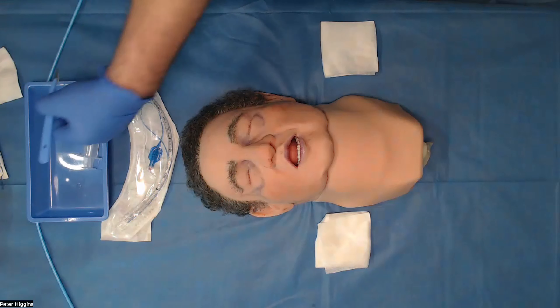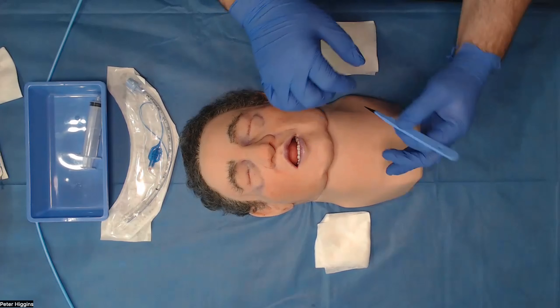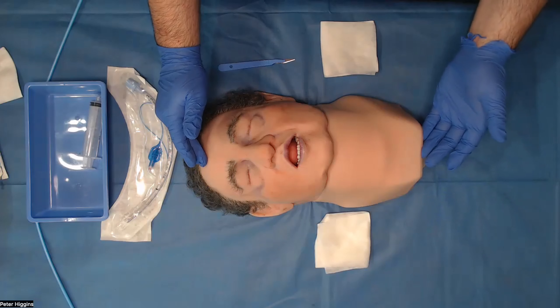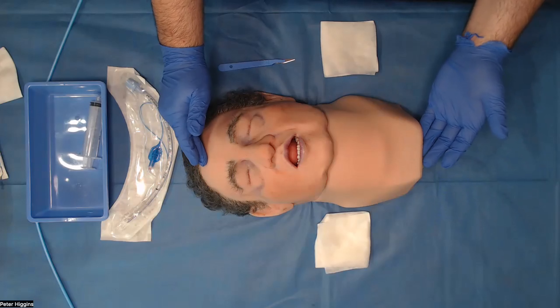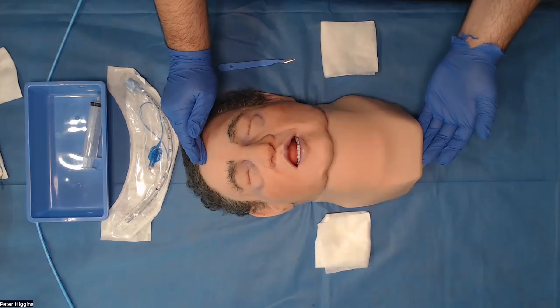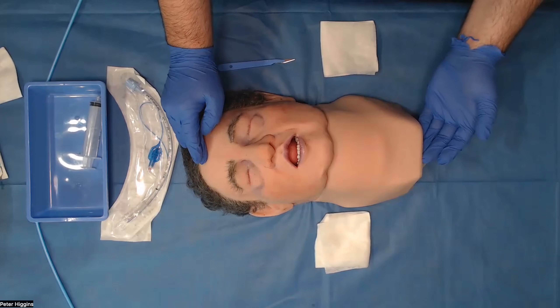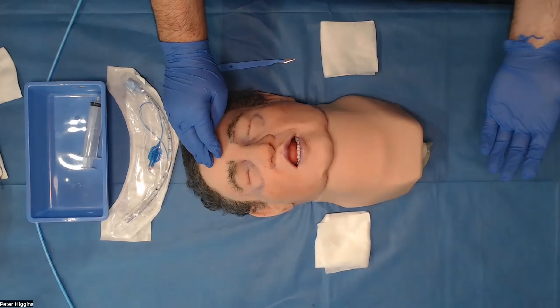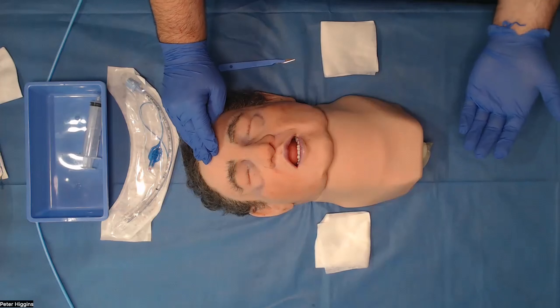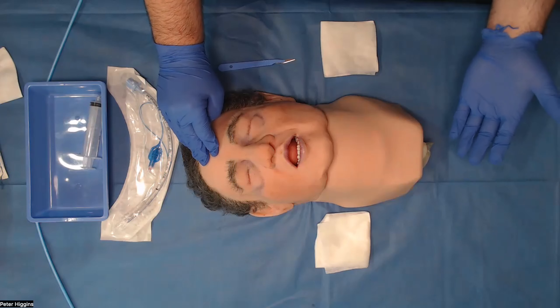I'm going to demonstrate the intended uses for Conan here. In this situation, the can't intubate, can't oxygenate scenario, it's quite a stressful scenario for people to go through in real life. Simulating it is a very good way of trying to get over some of that stress and giving people the permission to perform the procedure. It's a very stressful scenario to be in.